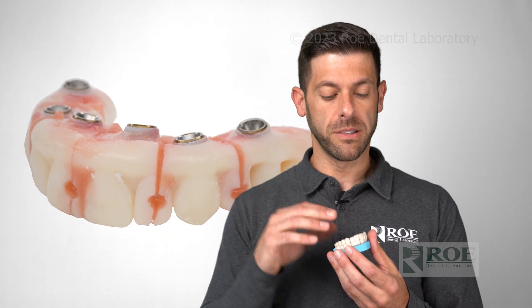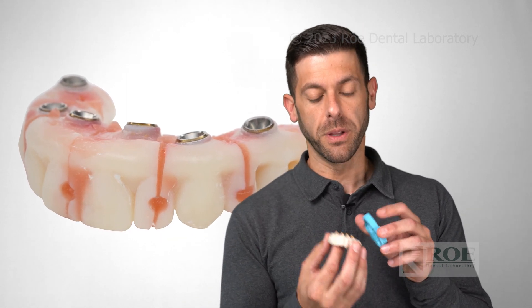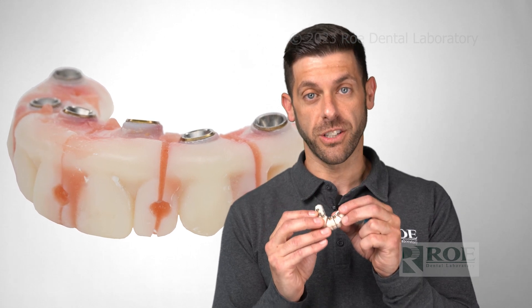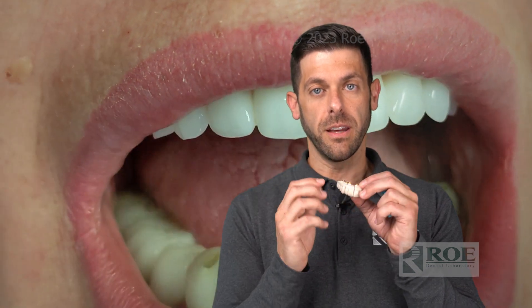All the scans have been sent and we fabricate a duplicate of the patient's prosthesis. As mentioned, it comes sectioned. The next step is to unscrew the patient's existing prosthesis and then screw each one of these sections into each of the implants. You want to make sure they're nice and passive and that they're not touching each other at all.